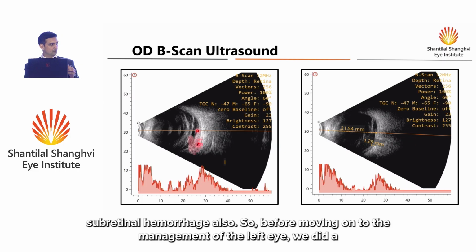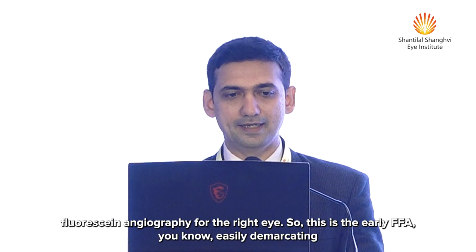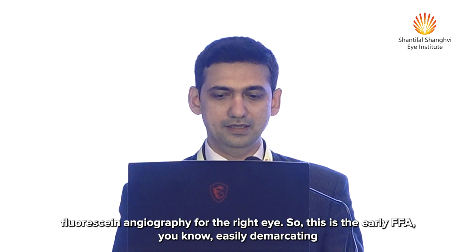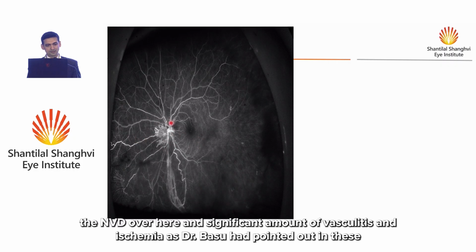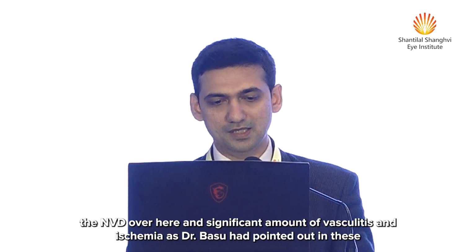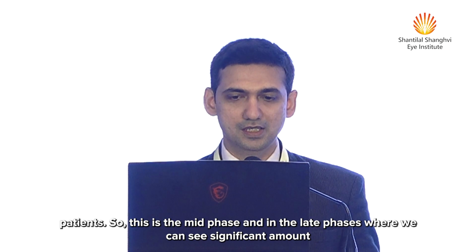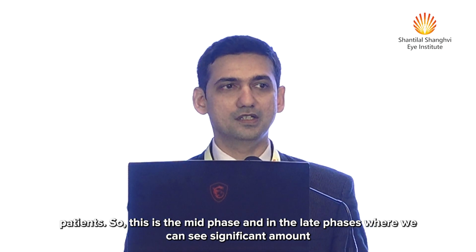Before moving on to the management of the left eye, we did a fluorescein angiography for the right eye. This is the early FFA, easily demarcating the NVD, and a significant amount of vasculitis and ischemia, as Dr. Basu had pointed out in these patients. This is the mid phase, and in the late phases we can see a significant amount of leakage in this eye.